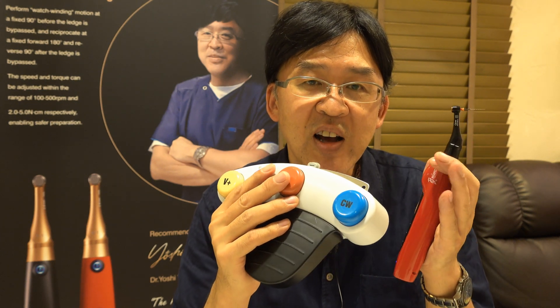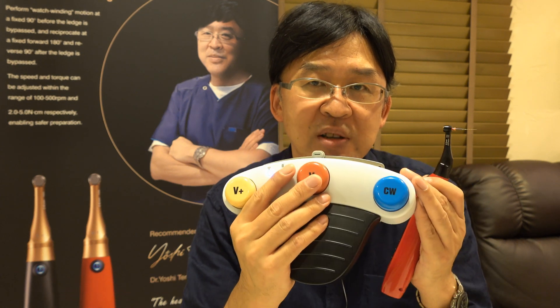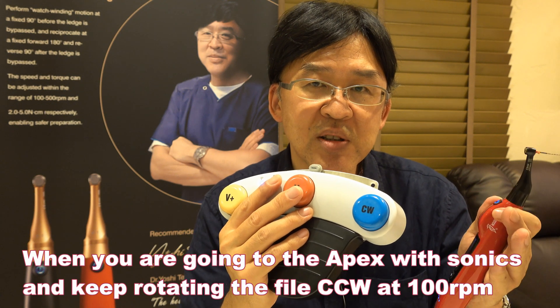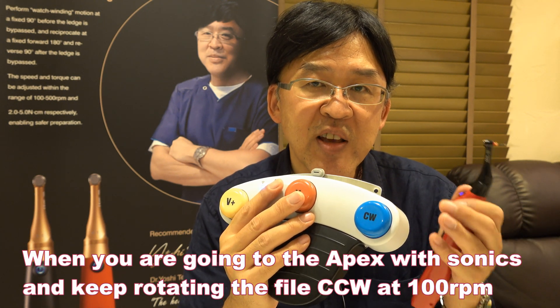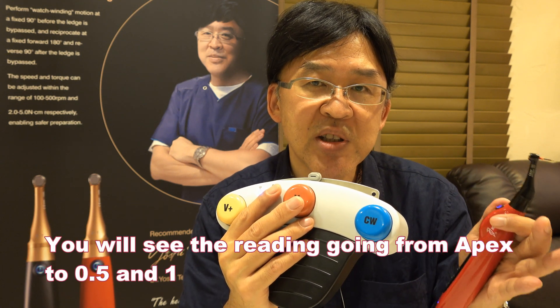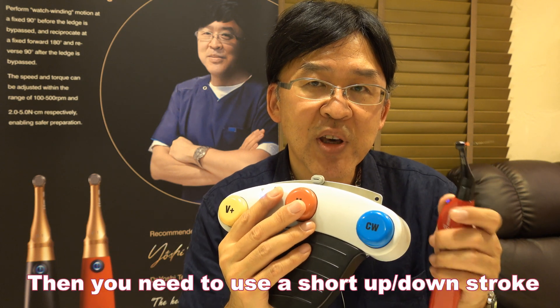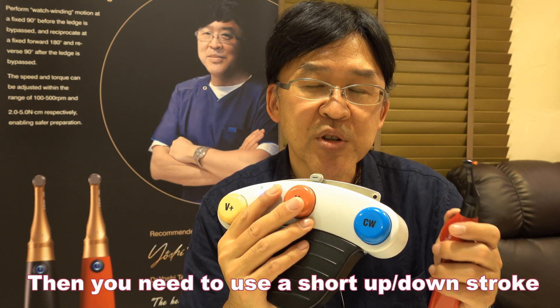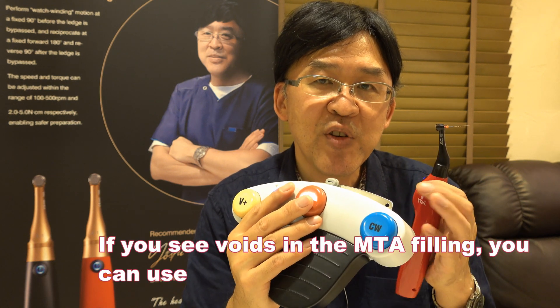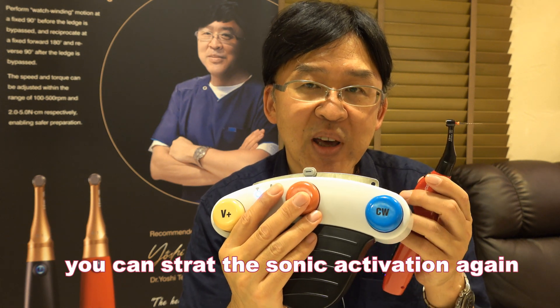You can actually remove voids with sonic. Going to the apex with sonic, if you keep rotating the file counterclockwise at 100 RPM and see the reading going from apex to 0.5 or 1, then you can use small up and down motion to keep condensing MTA. Then, if you see voids, you can start activation again.